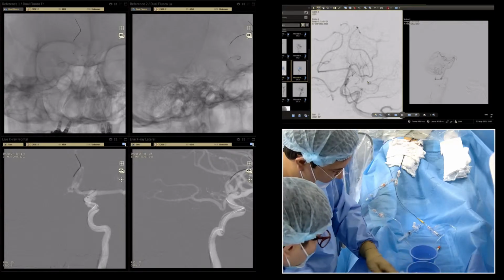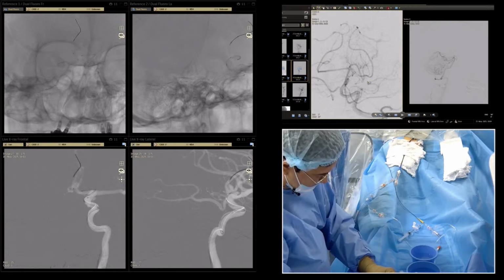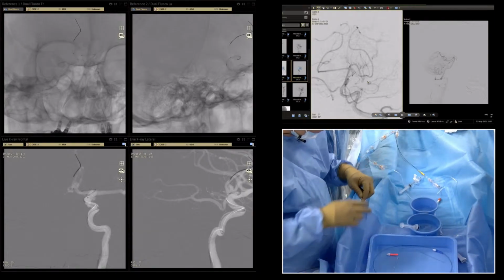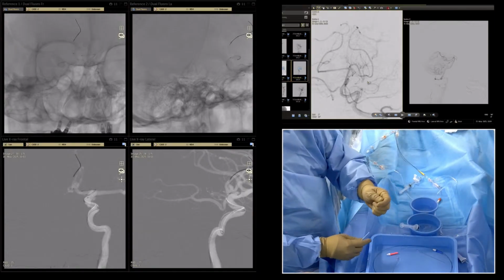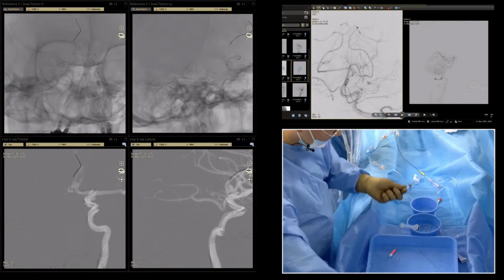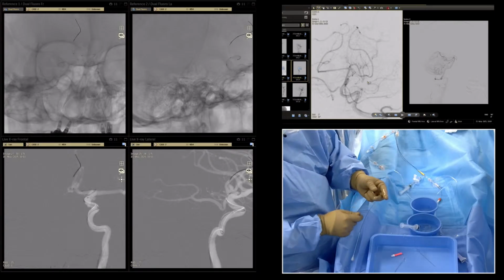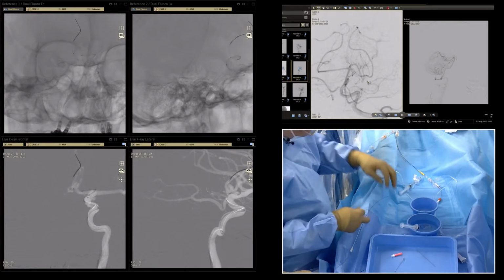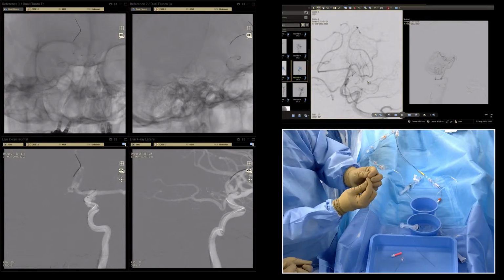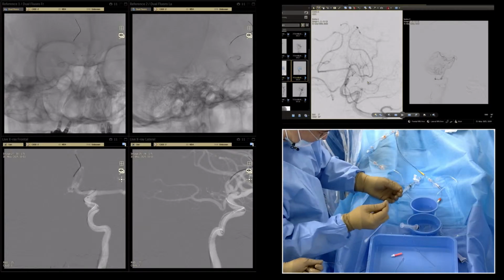Okay. Yes, you can compare how it's staying, and let's compare this wire. Okay, this is the Chikai, the last 10 centimeters, and this is a comparison with Chikai Black.